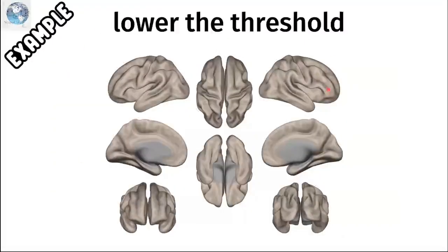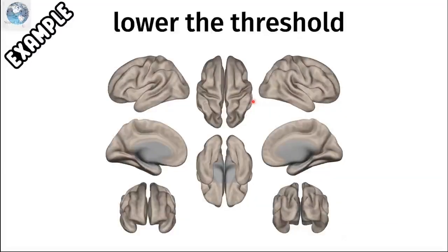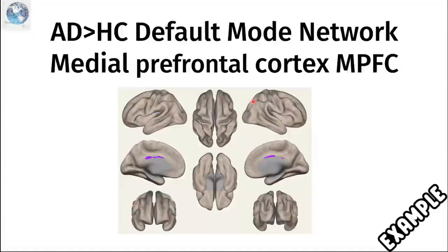So this is what is meant by there is no activity. That's why you need to play with the threshold and the cluster. You need to understand the inferential statistics mentioned by Dr. Aini so that you can understand how to get this activity. Otherwise, you get a brain without activity. This is also an example of images with no meaning.